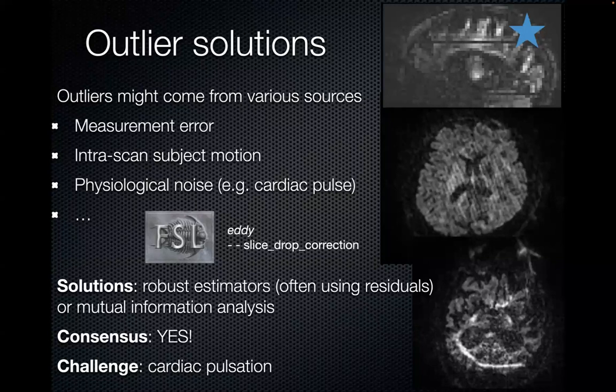By the way, everything I'm showing today, slowly and not surely, I'm laughing and you see where I'm going with this. All these bricks are suddenly replaced by a deep learning process, right? It's not surprising. I'm not a big fan because all these deep learning techniques are trained on these tools. They're not trained on ground truth. They're trained on just other tools. So they're just replicating tools, but they go a little bit faster. And I can see the day in a few years where all these steps will be replaced probably by a deep neural net.